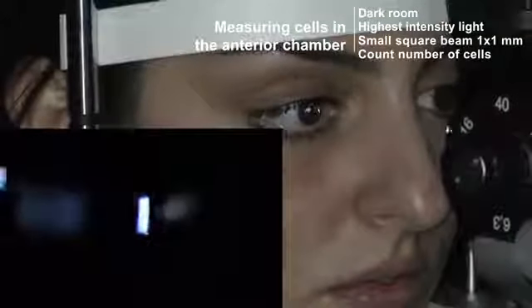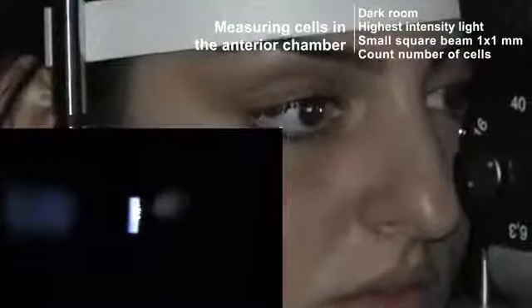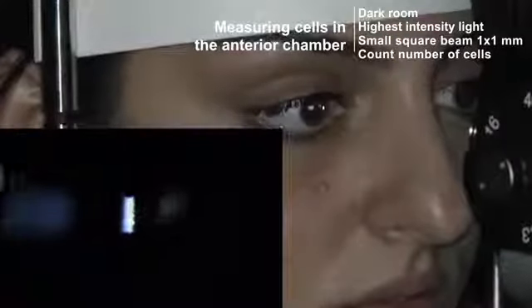I'm right in the center of the pupil here. I'm looking between the first beam, the bright beam, and the second beam to see if there are any cells, white cells or red blood cells, floating around. Here it's quiet. That's why we see the anterior chamber is deep based on the von Herrick method, and quiet because there are no cells here. Very important. So that's a nice view there.